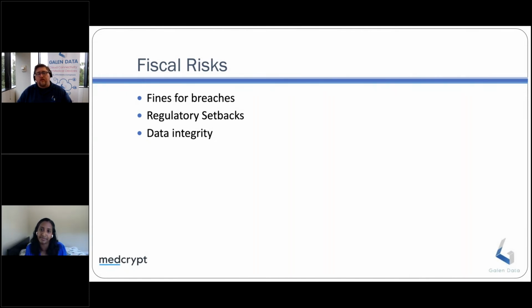If you're not doing the threat modeling, you're not doing end-to-end verification, which includes all of the security aspects of it, the FDA is very willing to kick your application back and say, well, go fix this, and we'll put you into another 90 or 180-day review when you resubmit those changes. And by the way, if you don't have everything that we're looking for, we're going to reject it again and go through that.